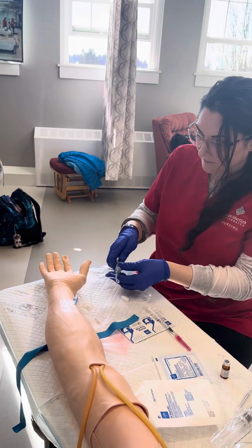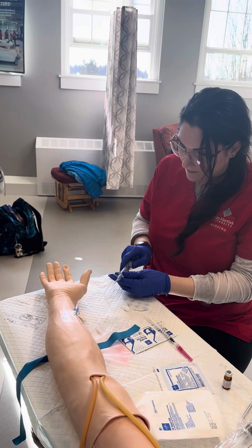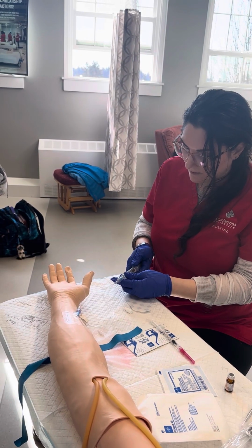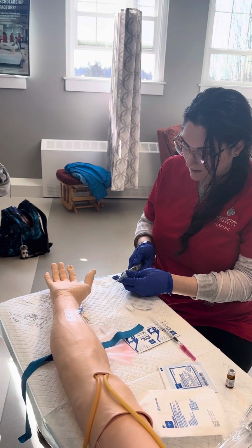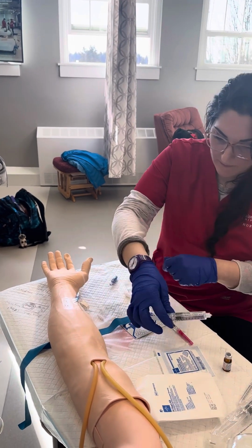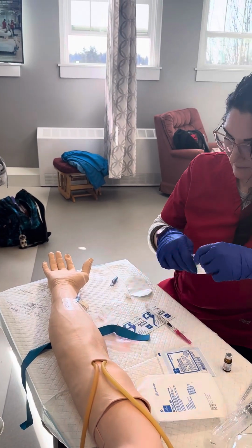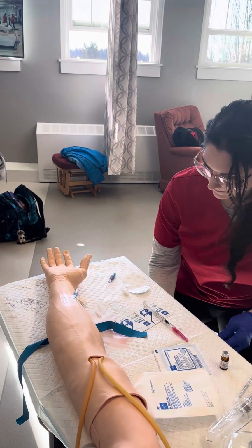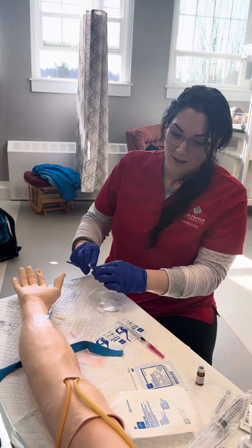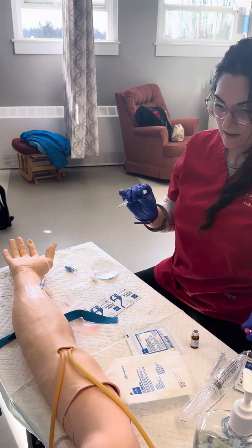Okay. I'm going to check for blood return again. Okay, got it. I'm going to go ahead and take that off, and then I'm going to clean that off for about 15 seconds. Okay. This goes in the sharps container.